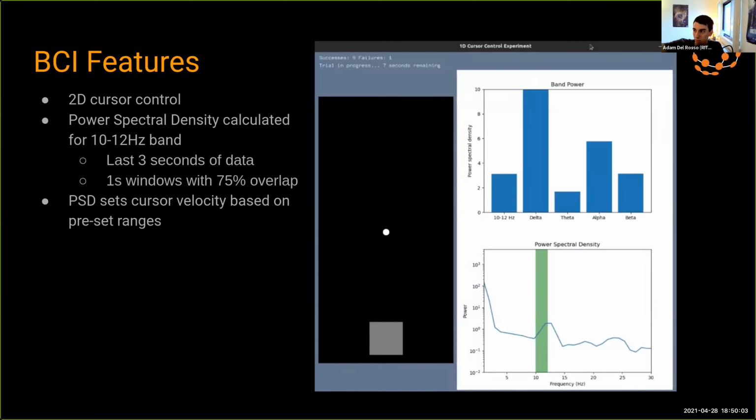But again, we're working with hardware that is probably a fraction of the cost that theirs was at that time. Thanks to technology improvement and the work of OpenBCI, among others, we get this pretty awesome hardware at a much lower cost, on the order of $1,000 for this system. So I really wanted to validate that with this lower cost system that we can get pretty much right off the shelf, that we have multiple of within the NXT organization, we're going to be able to see this EEG information that other researchers have been.